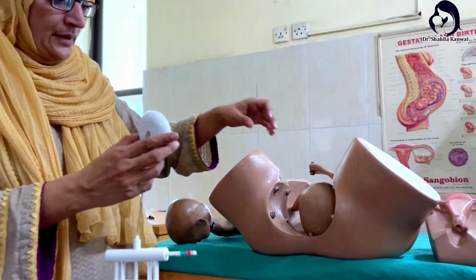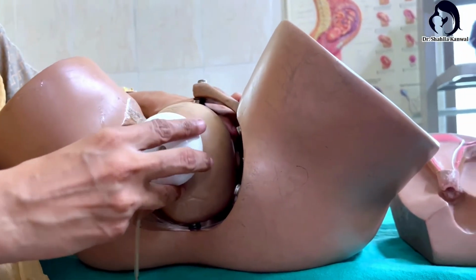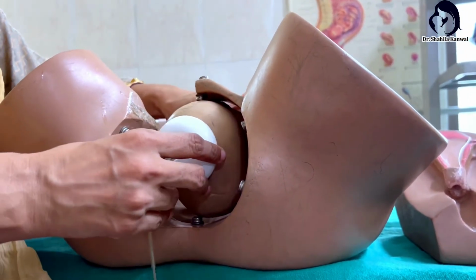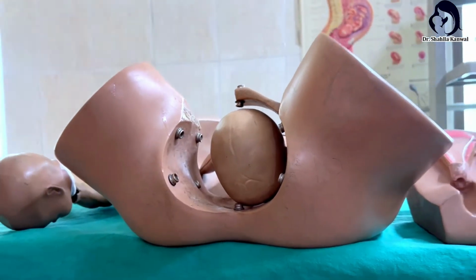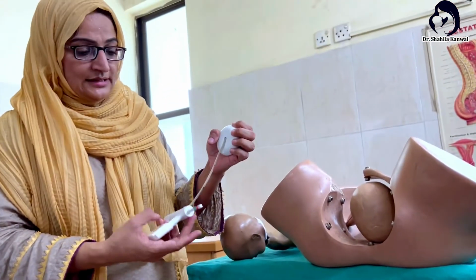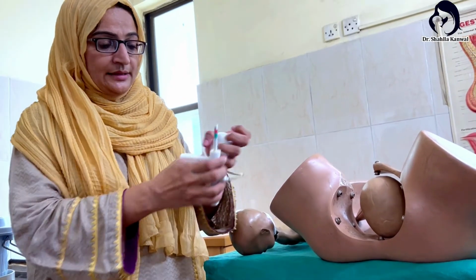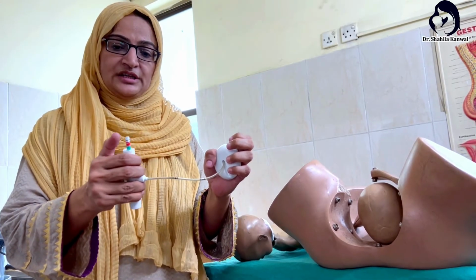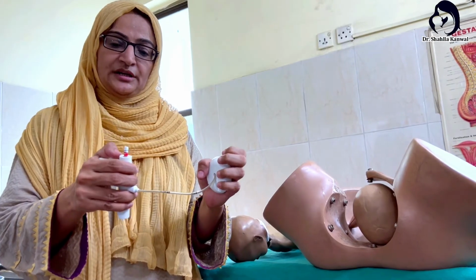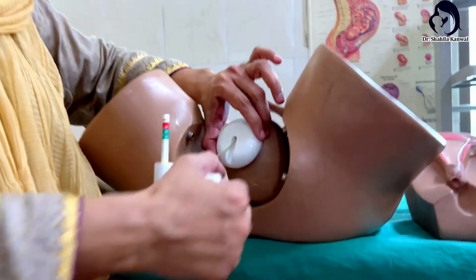So how will you apply this Omni cup? This is the flexion point. You have to apply this Omni cup over this flexion point, and you have to hold with these two. Before application, first you can check it over your own hand to create the suction pressure, so that the apparatus can be checked like that. The whole of this red, up till green, should be inside. To relieve the pressure, you have to press this button and the pressure will be released. So you will apply the Omni cup over the flexion point.